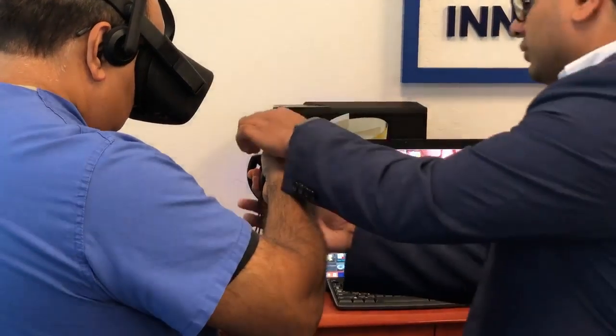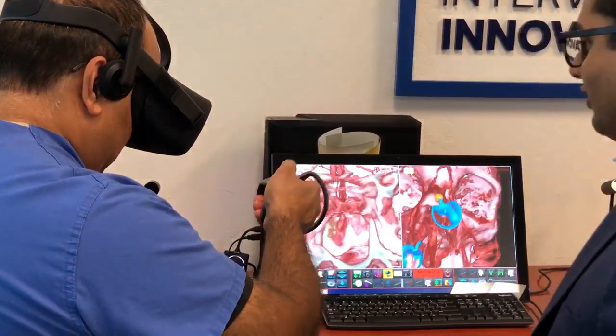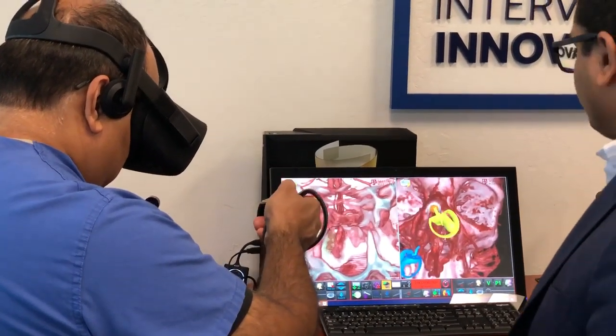And now, pause right there for a second. Put your thumb on the controller right here. Press down on it — you feel that buzz? Hold that thing, hold the button down. There you go.